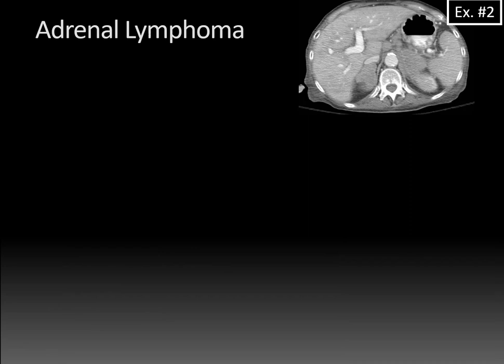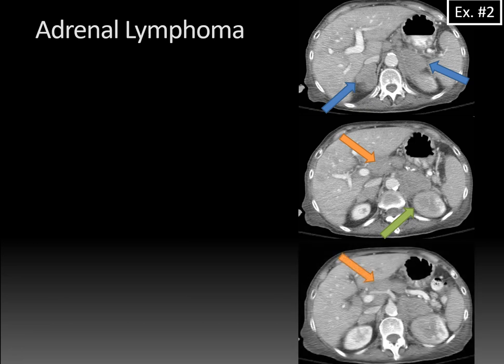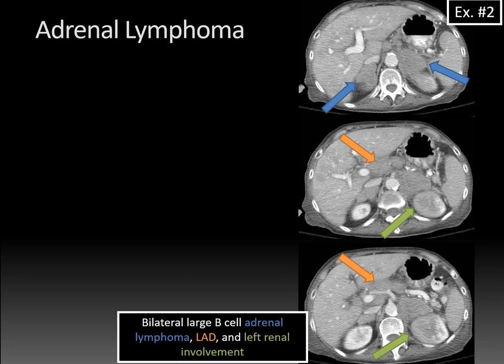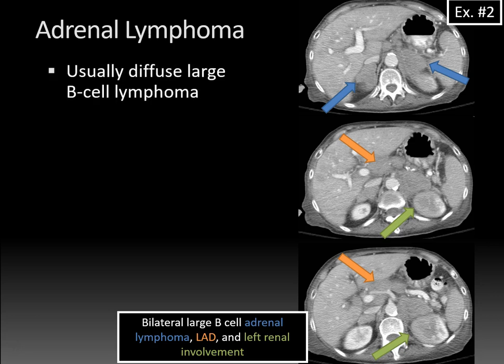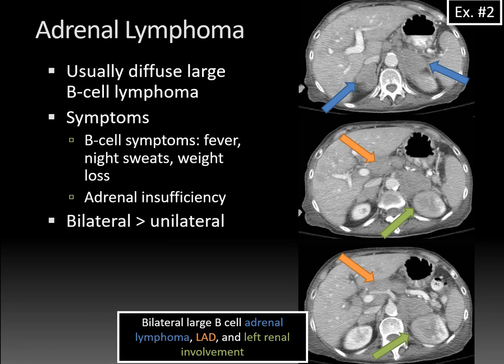Here's a different, more dramatic case showing bilateral large adrenal masses that are adreniform in shape, hypodense and ill-defined. There's also lymphadenopathy in the portohepatic and peripancreatic region, and infiltrative hypodensity into the left kidney. All these masses are relatively isodense to skeletal muscle on CT — a typical feature for lymphoma. This was a patient with bilateral large B-cell adrenal lymphoma with metastatic lymphadenopathy and left renal involvement. Adrenal lymphoma is non-Hodgkin's lymphoma, usually diffuse large B-cell lymphoma. Symptoms often include B-cell symptoms like fever, night sweats, and weight loss, as well as adrenal insufficiency. They tend to be bilateral and may invade into the adjacent kidney.